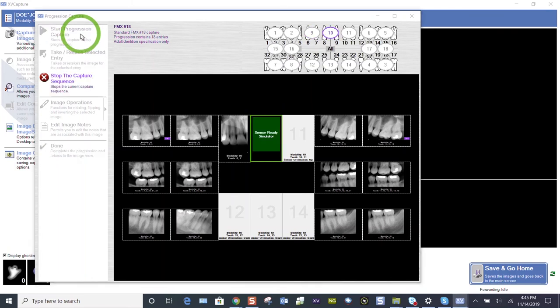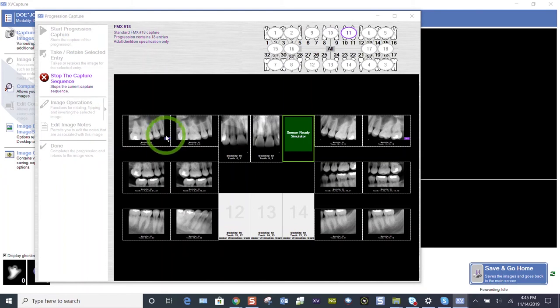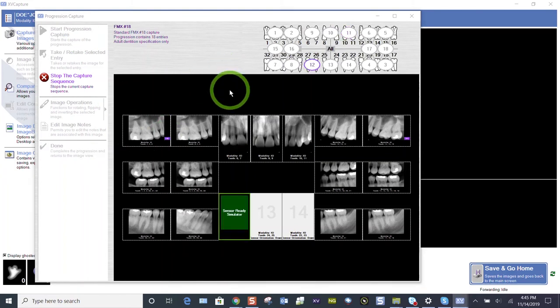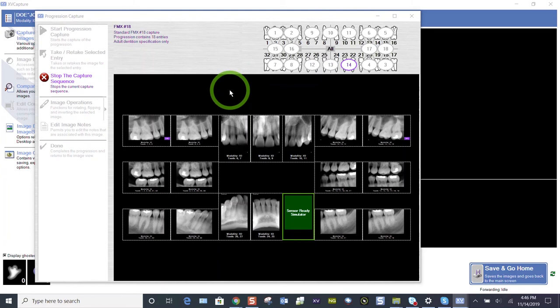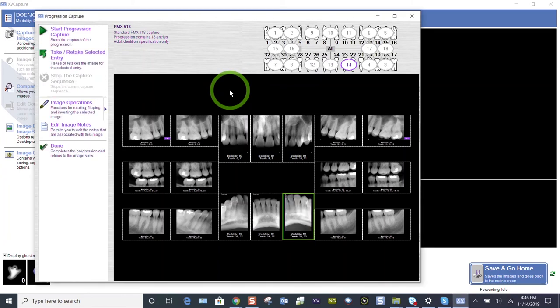Even if the sensor is in ready mode, you can still look at those retakes. You can click on those tiles that you retook on the fly and identify which image you prefer. I retake my FMX-18 images on the fly as I go. And then also I take this moment to assess, do I need a retake anywhere else? Maybe I didn't get the distal of something.